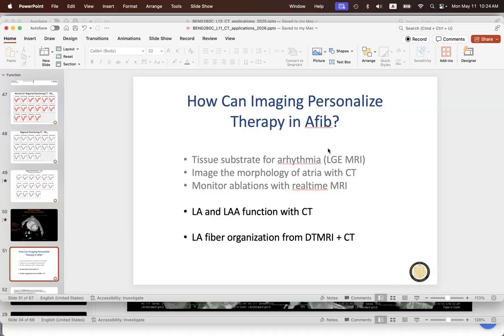With modern CT scanners, this is where I think the CT scanners that have the wide detector, such that you can image the entire heart in a single rotation, have a tremendous advantage for these patients, people in AFib, because you really only need one good beat or a QRS, and you can make an image of that beat. So, in looking at what we can do for patients in AFib, we can look at the tissue itself.